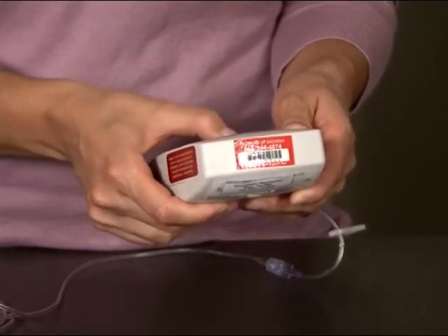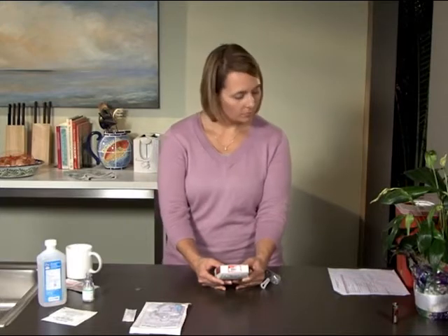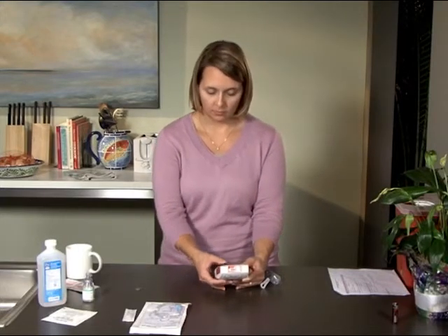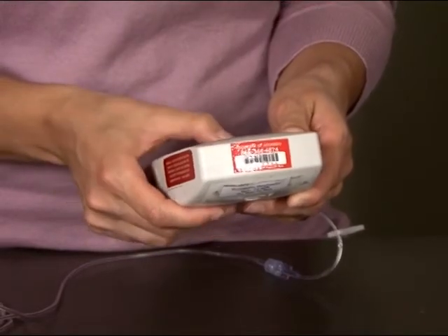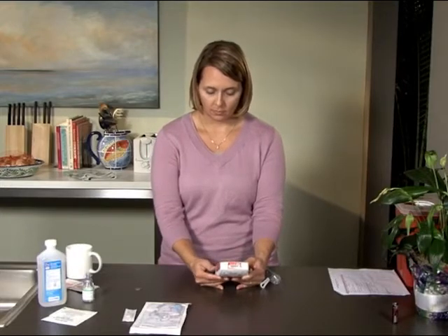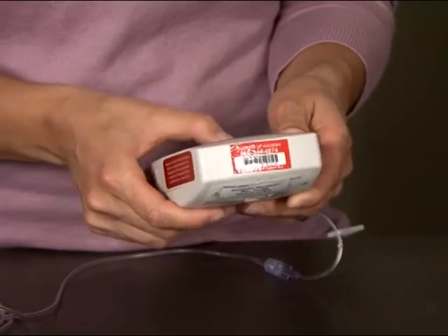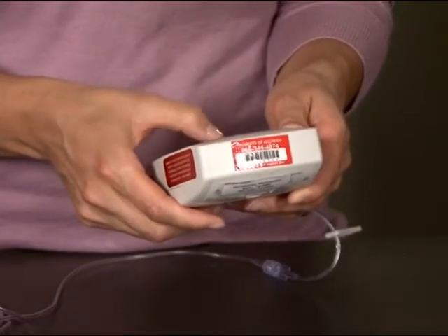Once you've set the reservoir volume, press the next button. The screen will display the dosing rate. Check your dosing sheet to determine your rate, then use the up or down arrows on the pump to set the correct rate. Press the enter/clear button to save the new setting. If you forget to press enter, the screen will display a message that tells you the setting has not been saved. Simply press next to return to the rate screen, program your rate, and press enter to save the setting. Then press next. Clear the amount given every time you put on a new cassette by pressing the enter/clear button. Press the next button until the pump displays stopped.